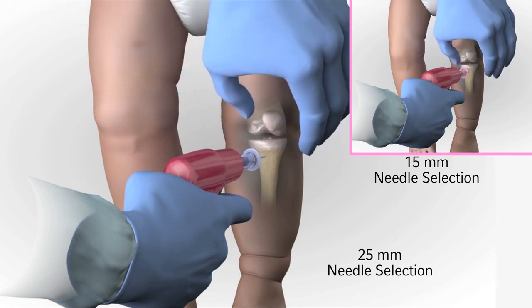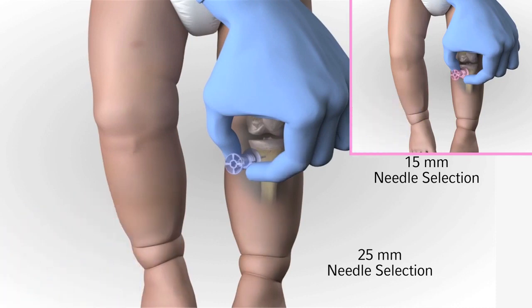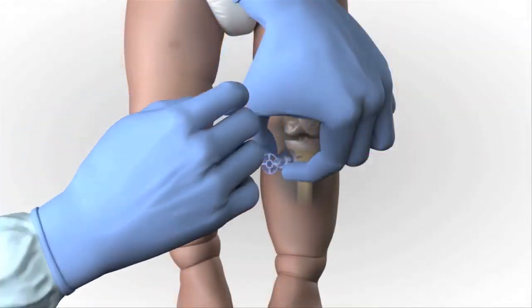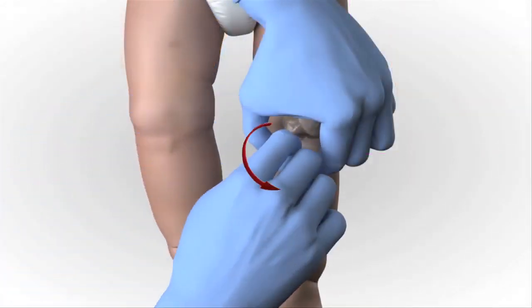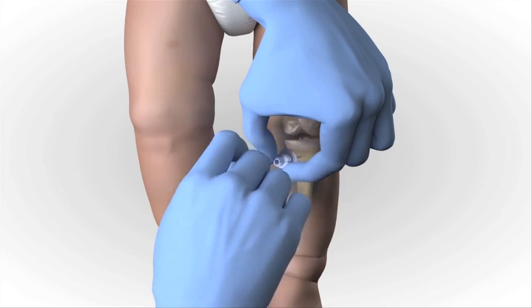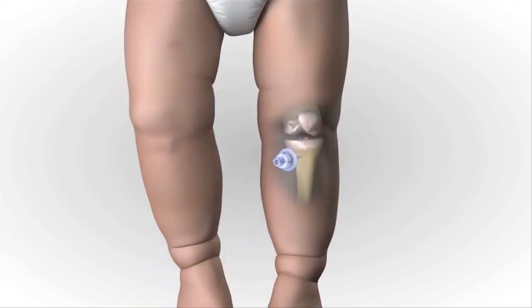Hold the hub in place and pull the driver straight off. Continue to hold the hub while twisting the stylet off the hub with counter-clockwise rotations. The catheter should feel firmly seated in the bone. Place the stylet in a sharps container.